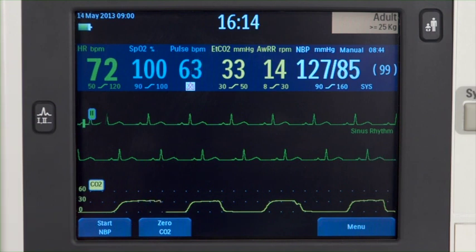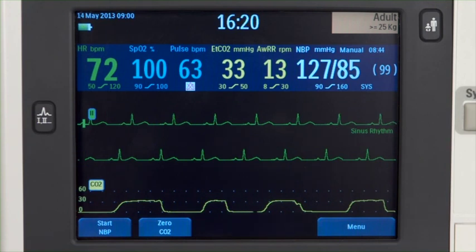With the HeartStart XL Plus, you can monitor ECG, pulse oximetry, non-invasive blood pressure, and carbon dioxide.